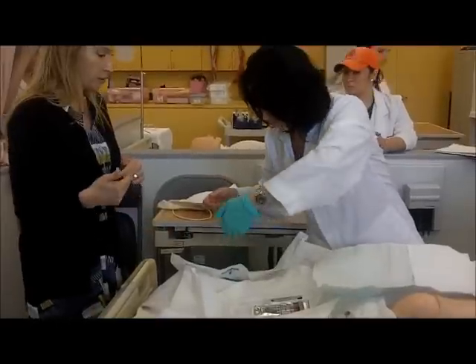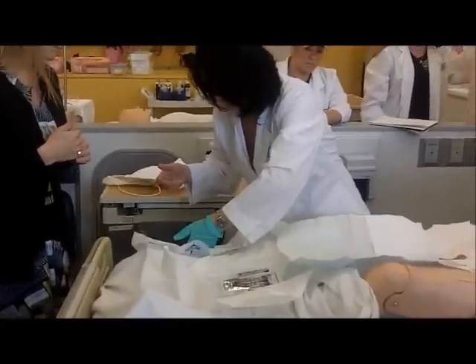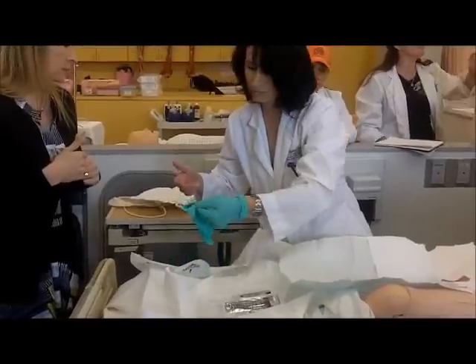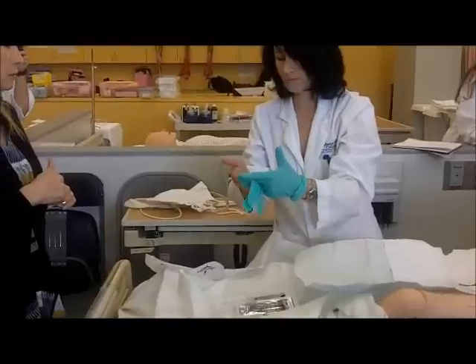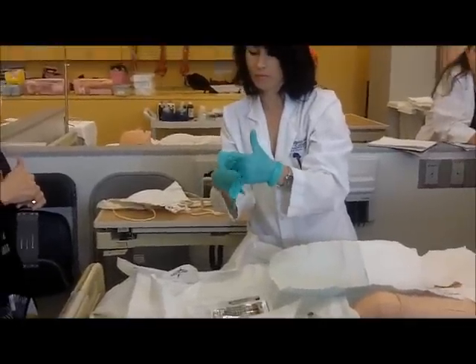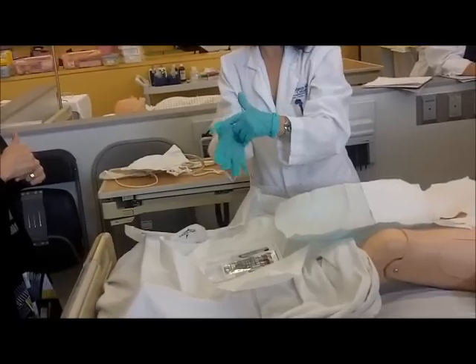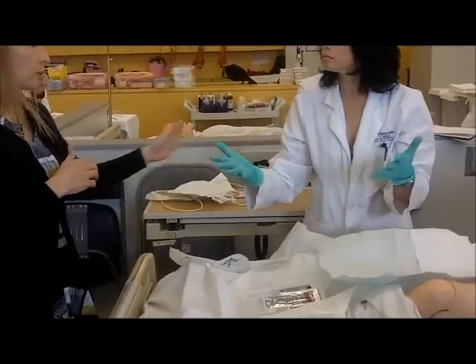Now make sure you use the cuff part so that you don't go to the inside. Can you put gloves on the table? Can you just move it to the table and put it on there? If you want, you can do your gloves there.